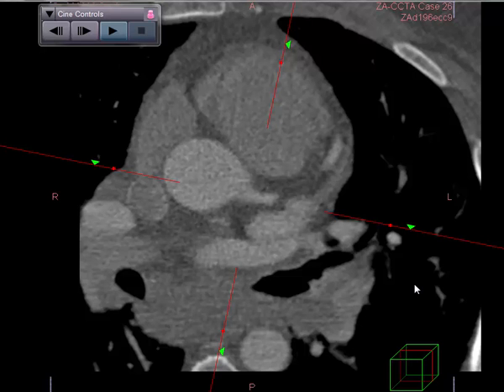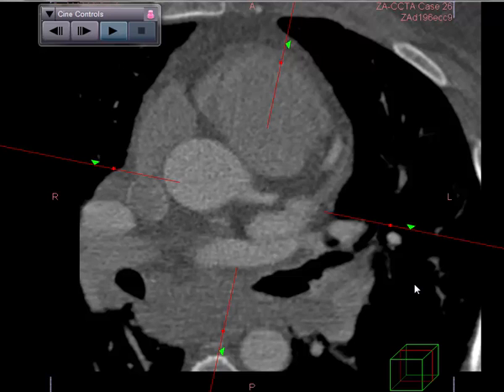This is CCTA case number 26. This is a 35-year-old man with a history of high cholesterol who has had progressive dyspnea with effort over the past several weeks.